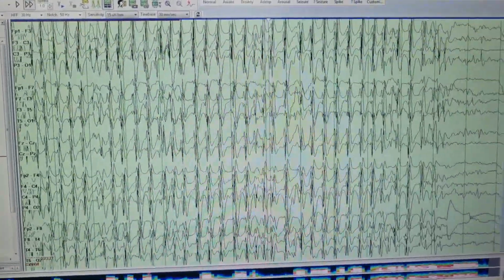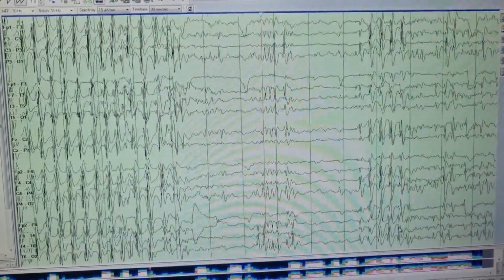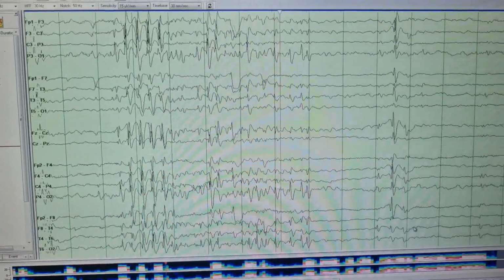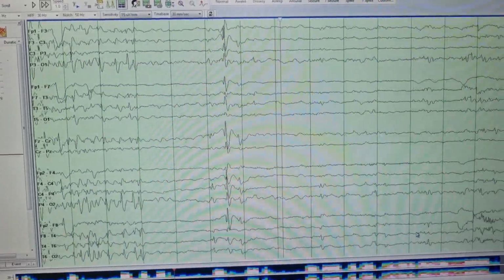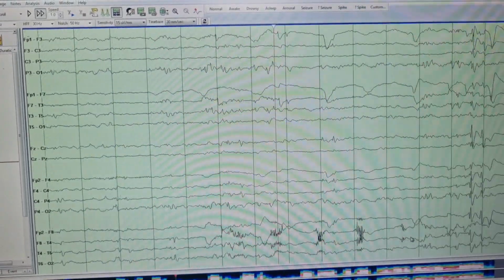Now next comes whether, with these electrographic seizures, our child is having non-convulsive status epilepticus or not. For labeling non-convulsive status epilepticus, these electrographic seizures should persist for 10 minutes or repeatedly occur over a 10-minute period. Or if you perform the EEG for at least 1 hour, then these should occupy 20% of the EEG recording, that is about 12 minutes.